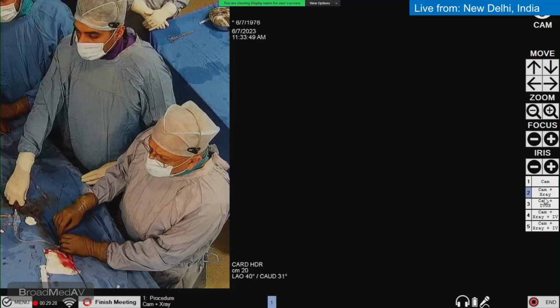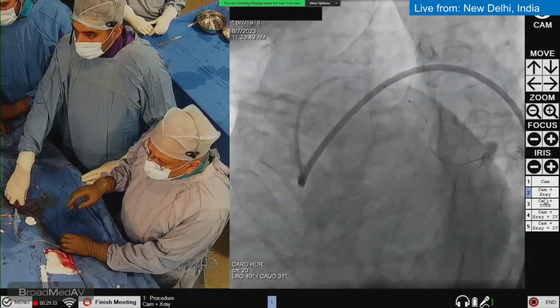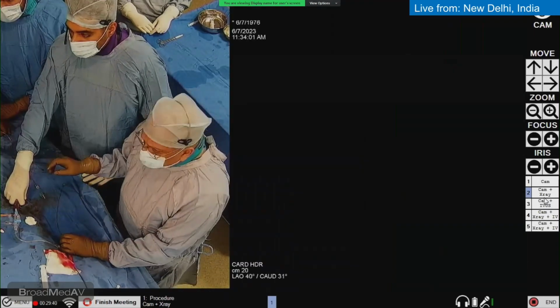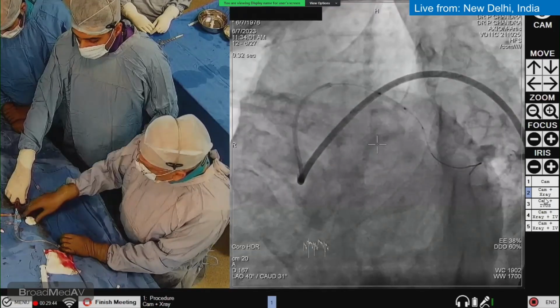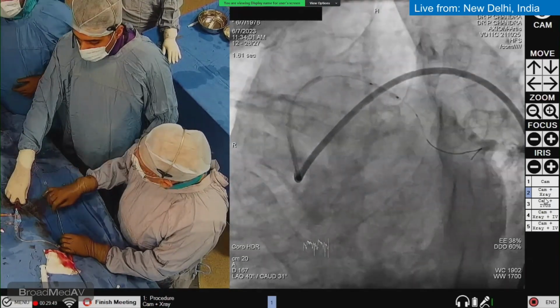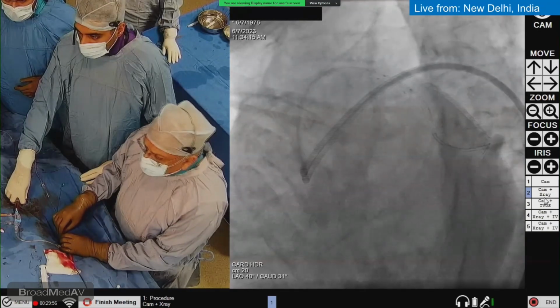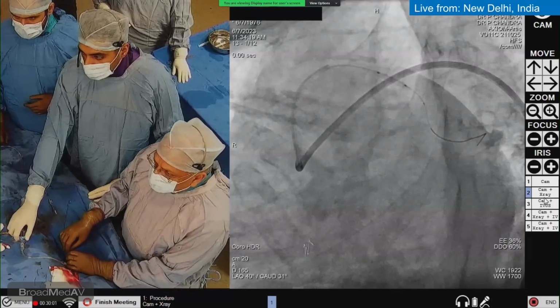And go up, please. So we did IVUS also in between. We'll show you some IVUS images. 1, 2, 3, 4, 5, 6, 7, 8, 9, 10, 12. So we go to good pressures because the vessel is like 2.7, 2.6, 2.7. We have gone to 2.7 now. With 12, it becomes about 2.7, and the balloon is well expanded. I'll take a shot and then we'll deflate.